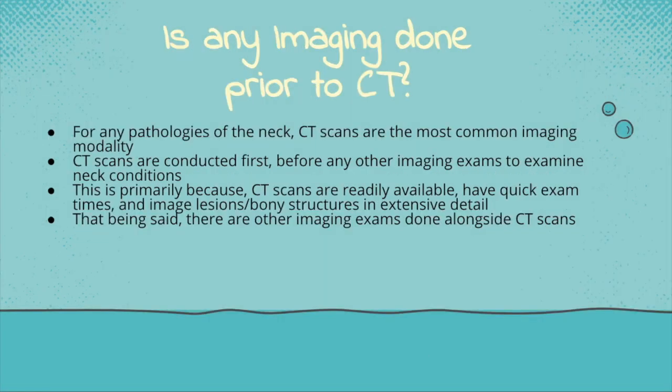Is any imaging done prior to CT? For any pathologies of the neck, CT scans are the most common imaging modality. CT scans are conducted first before any other imaging exams to examine neck conditions. This is primarily because CT scans are readily available, have quick exam times, and image lesions and bony structures in extensive detail. However, that being said, there are other imaging exams that are done alongside CT scans for further investigations of neck conditions.